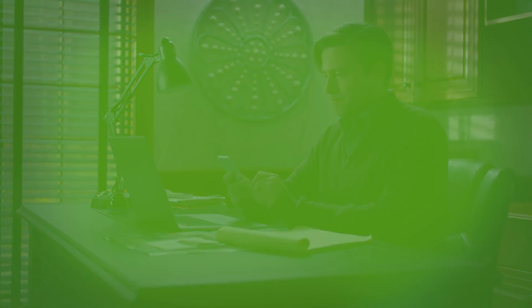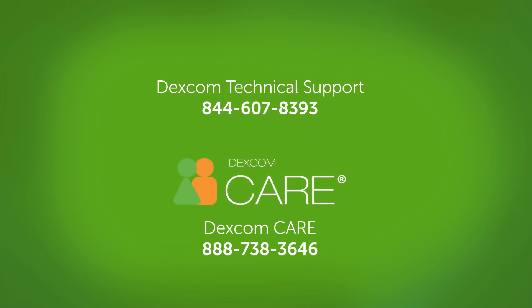And that is how you set up Dexcom Share and Follow. It really offers me peace of mind to know my husband will be following me while I travel. Of course, if you have any questions, call Dexcom Technical Support or Dexcom Care.